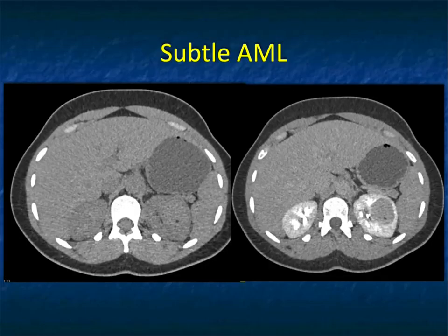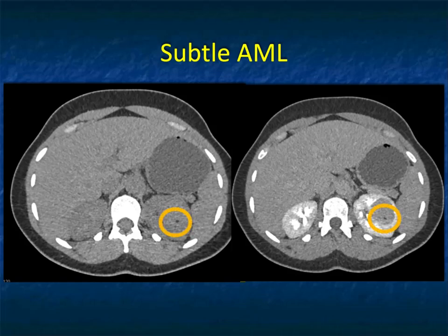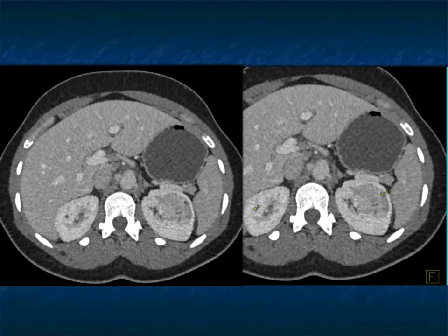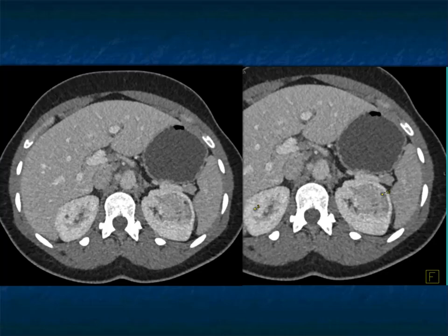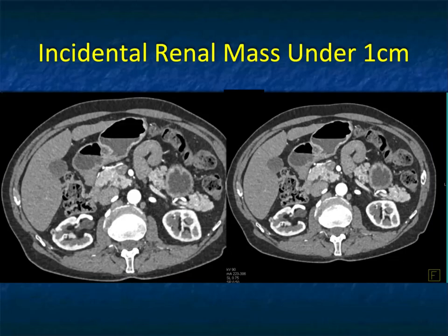What about this case? Look at the patient's left kidney — it looks like a mass on the non-contrast, and there's a little dot. With contrast in the excretory phase, there's still that little dot. If you pay attention to that dot and measure it, and notice there are several other little dots measuring negative Hounsfield units — this is a wonderful example of a fat-poor angiomyelolipoma. When you have a well-defined mass with minimal fat, that's an angiomyelolipoma, and you could stop right there.